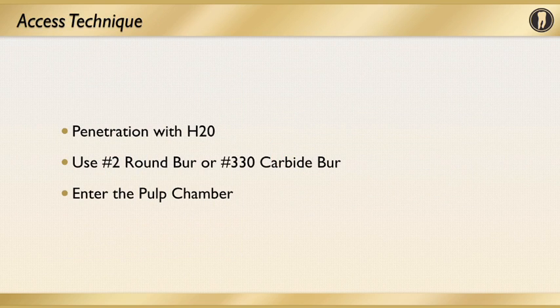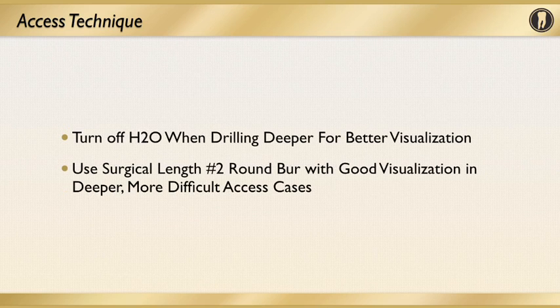Let's again just make sure we have this access technique down. You want to start your access prep with the water on. I do this to help prevent the dust from going in the patient's nose, and I'll make about a 2 to 3 millimeter access depth. Then I will stop, I'll turn the water off, my assistant will wash and dry the preparation. I will be able to look at it and make sure that I have the right angulation.